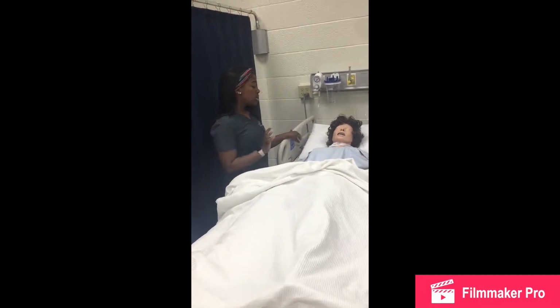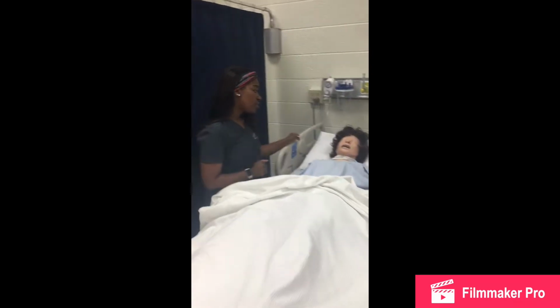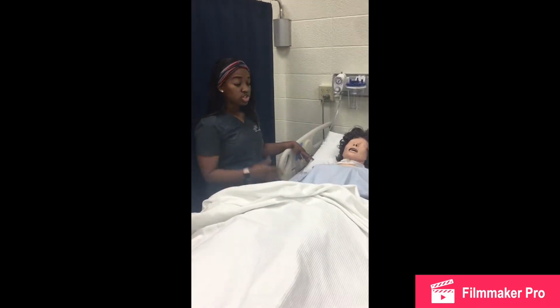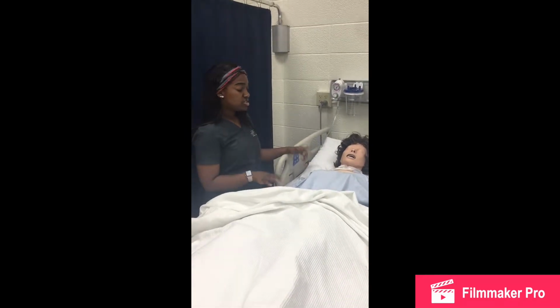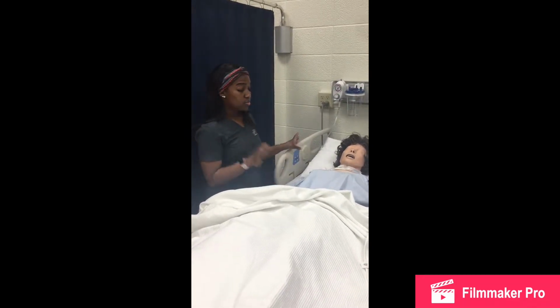Okay, great. Today we'll be doing a Foley catheter. Have you ever had a Foley catheter before? She states no. And then I'm going to ask her about her last urination. She says it was 2 days ago, so she is ready for the procedure.